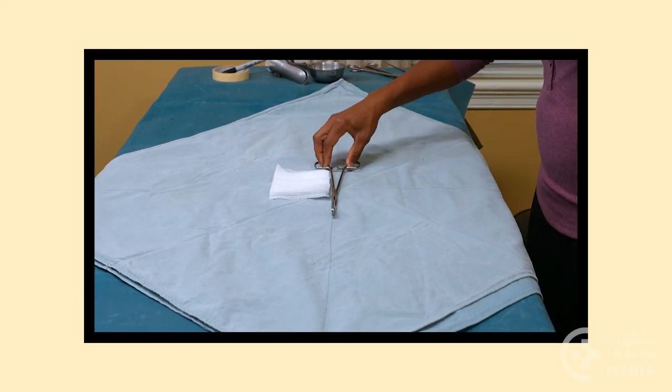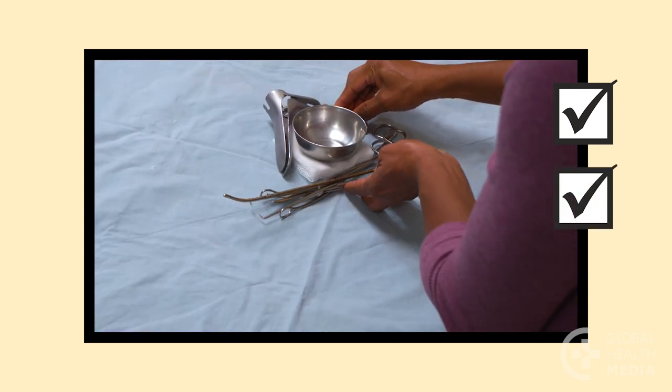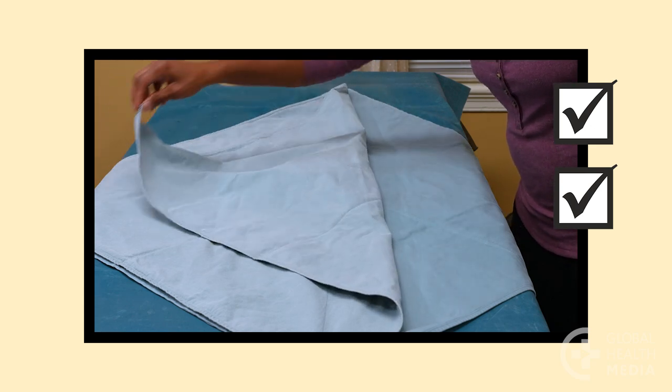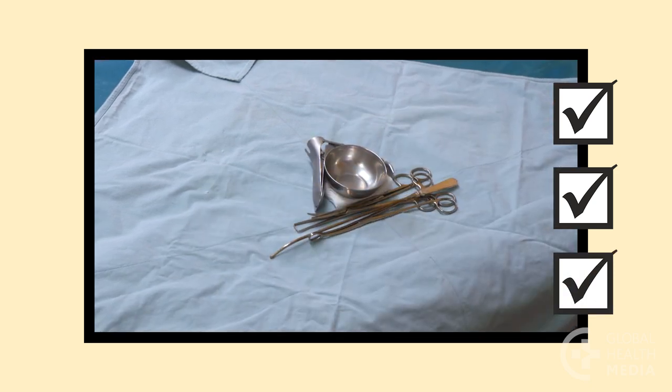Remember, keep instruments unhinged. Wrap surgical instruments correctly to sterilize them completely. A correctly wrapped package will open in a way that keeps all instruments sterile.